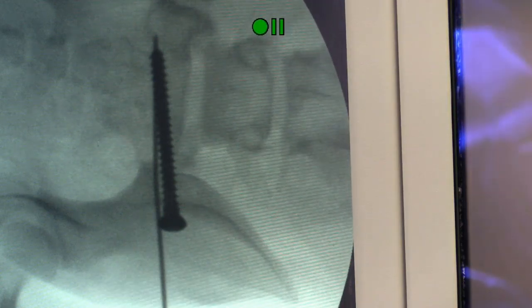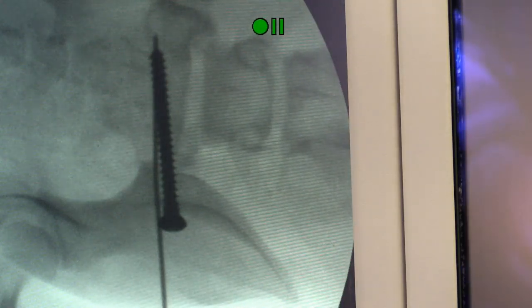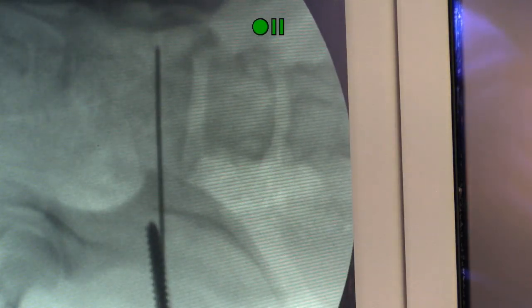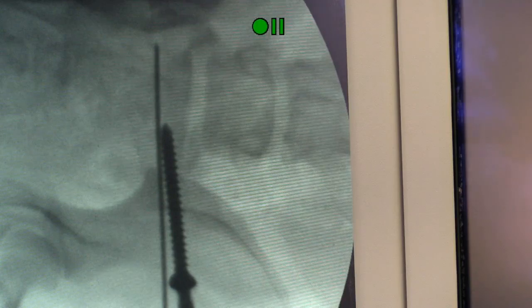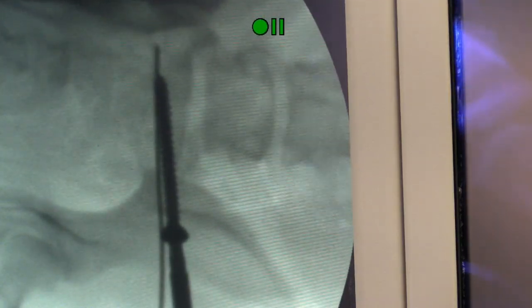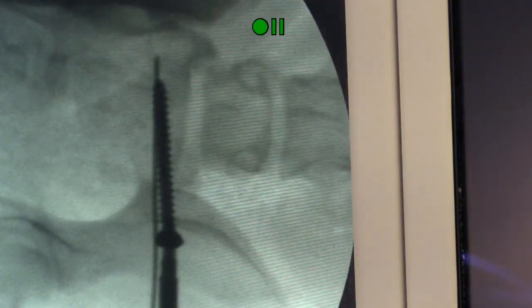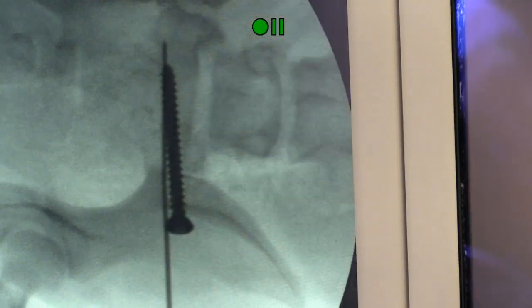And again, this is just accuracy that you don't get doing it open. Really paying attention to detail, I think this is important. Let's talk about the 1% as a surgeon and taking care of as many of those as possible to get the best outcome we can across the team. So you can see that screw head now is going to start to get down to that cortical line. And that looks great. I'd be really happy with that.